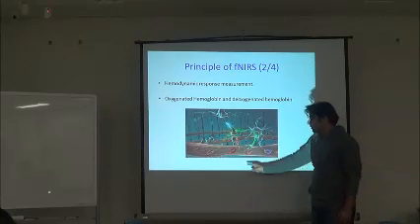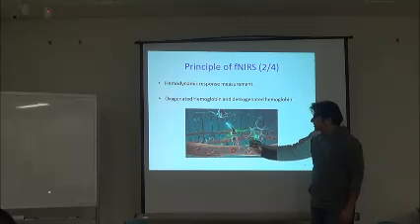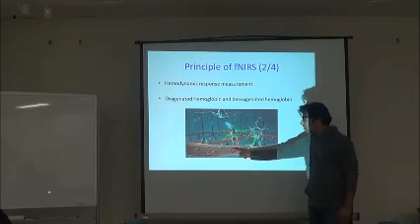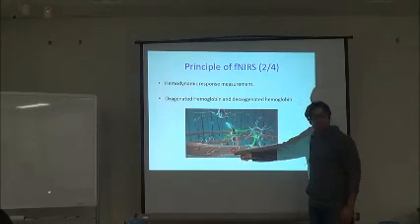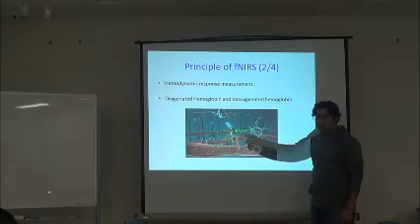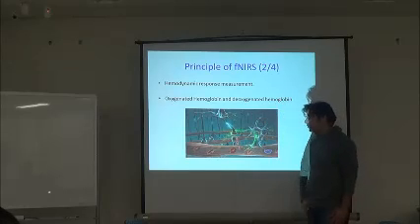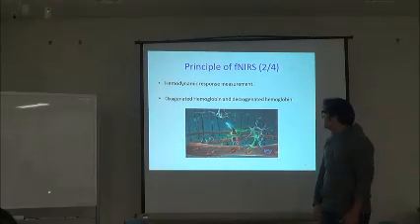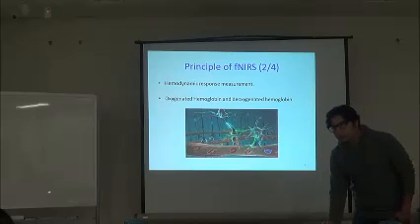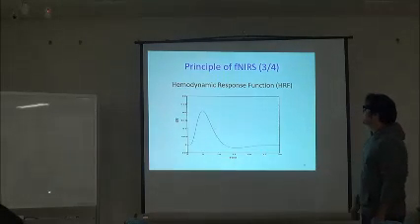But initially there is some dip, because as the process starts, the oxygenated hemoglobin decreases firstly, and then the blood supply is increased and it increases. So there is an initial dip which we are trying to detect as well, but there has not been much research on that so far.